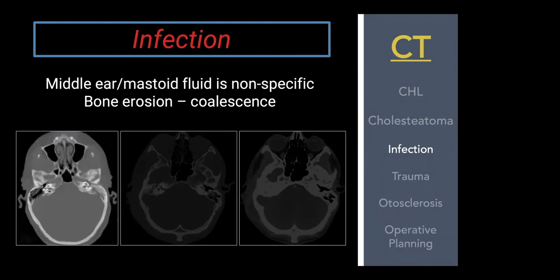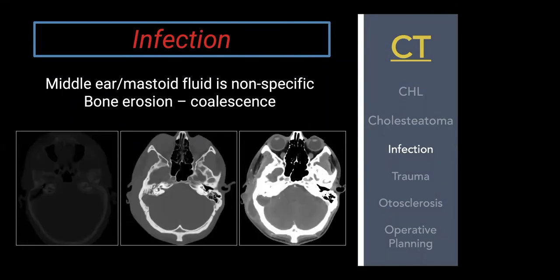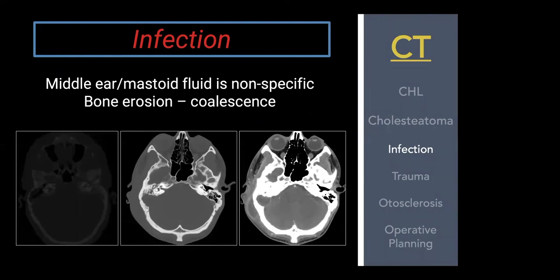On the left, the left temporal bone mastoid is completely opacified. More significantly, there is bone erosion of the mastoid septa and loss of the posterior mastoid wall — highly concerning for coalescent mastoiditis. In the middle case, on the bone window you see an erosive process in the right mastoid, and on soft tissue windows there is very low-density fluid in that area — a mastoid abscess. There's also a superficial postauricular scalp abscess. Together with bone erosion, this indicates coalescent mastoiditis that has spread extracranially.